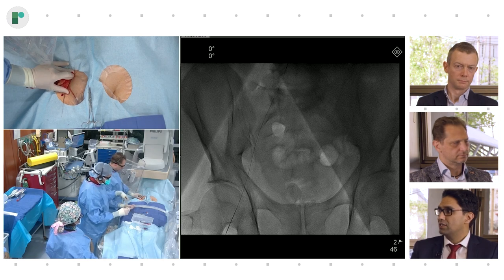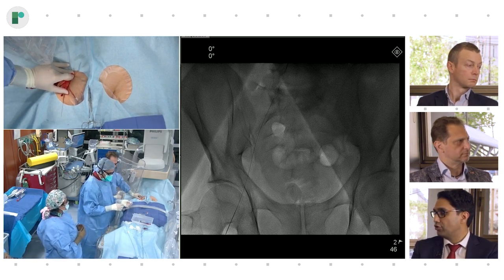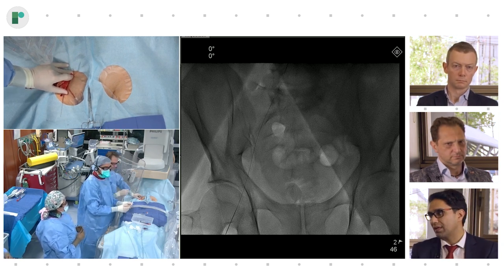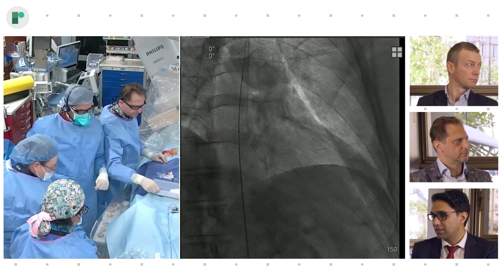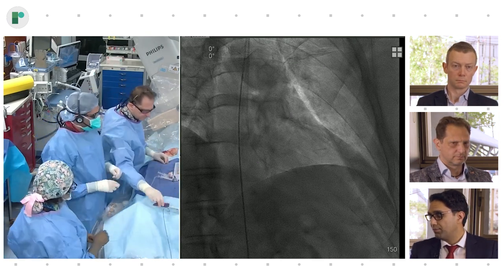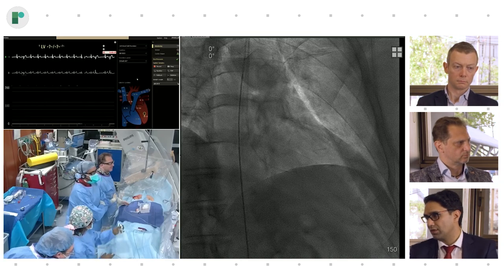But we need to be cognizant that that would be a major undertaking if the patient doesn't have access. Then you're talking about grafts and so forth, so it could be very complicated. And there is one study from India which actually shows that a repeated radial artery access leads to the inability to use this for fistula and ends up requiring more patients to have femoral artery grafts for dialysis, which of course is a bad thing.